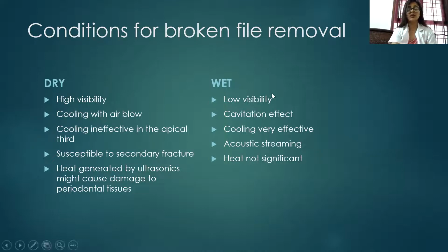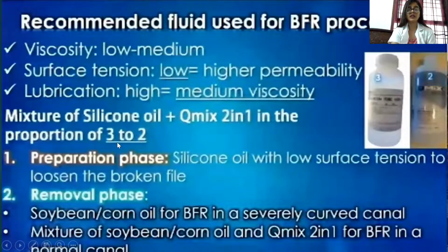In case of wet canal, low visibility, cavitation effect will be there. Acoustic streaming. Cooling very effective. Heat is not significant. Recommended fluid used for broken file retrieval procedures.